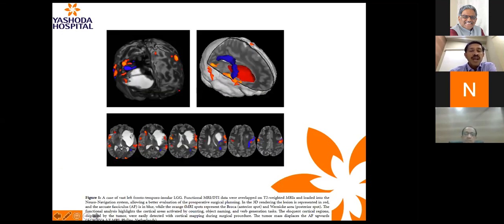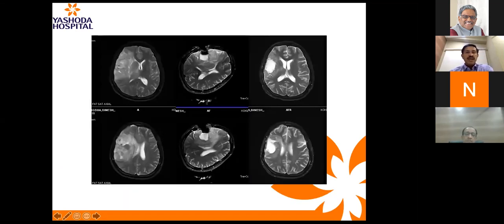So similar large lesions like this, one can study preoperatively. Here, the large lesion looks almost unresectable, but intraop MRI shows us that we still have a lot of lesion left anteriorly, which is also resected, and the patient has a decent cavity with the majority of the tumor totally excised, and these patients tend to have longer progression-free and overall survival.